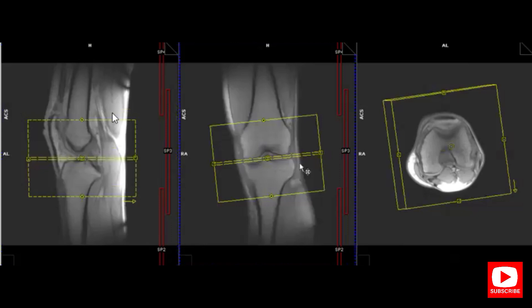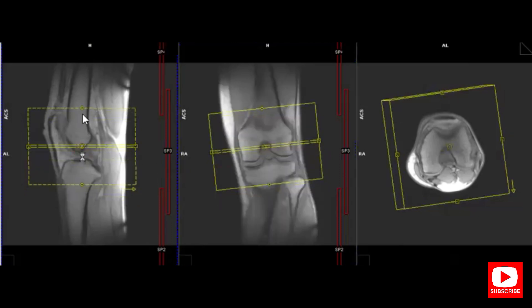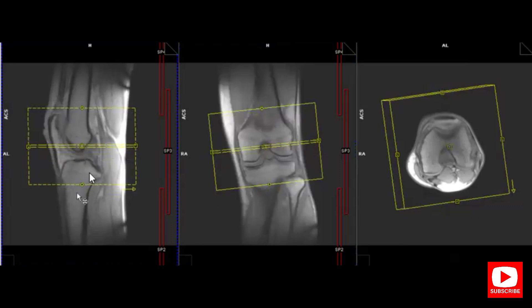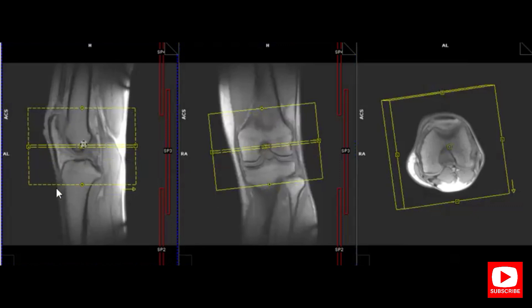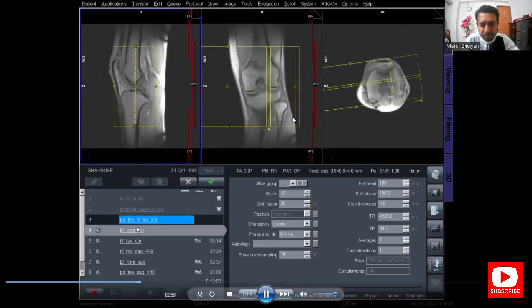Angle the slices on the coronal image so that the slices are parallel to the lateral and medial condyle of the femur. Cover the slices so that they cover from the tibial tuberosity to the upper border or superior border of the patella. Then click Apply.